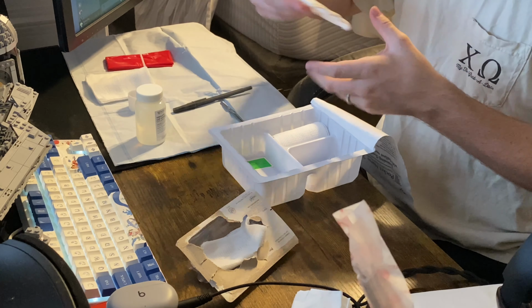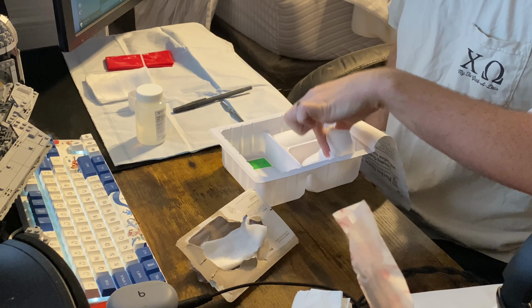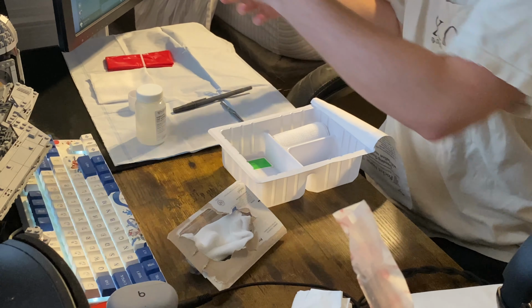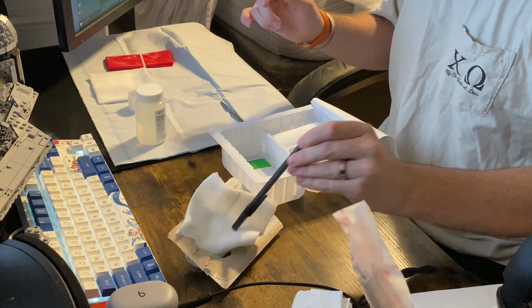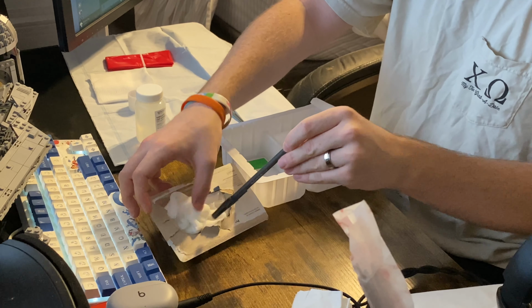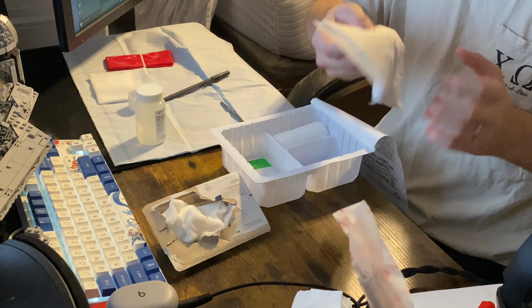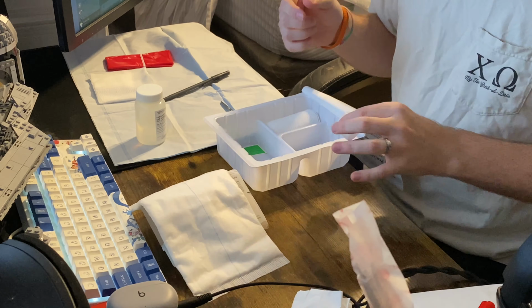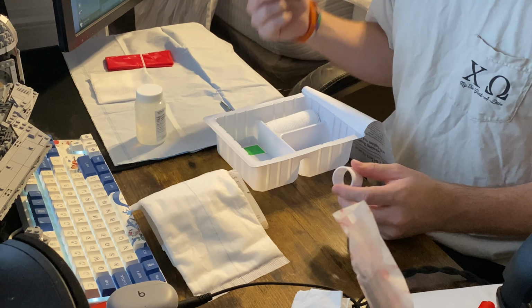We will continue to dampen with our one non-sterile hand and pack. I think we can get one more in there. We'll dampen and we will pack. And once we are packed in, you can use both hands. And then our last part of the job will be taking a new fresh bandage, putting it over the wound, taping it appropriately, and then writing the date and the time the dressing was attached.